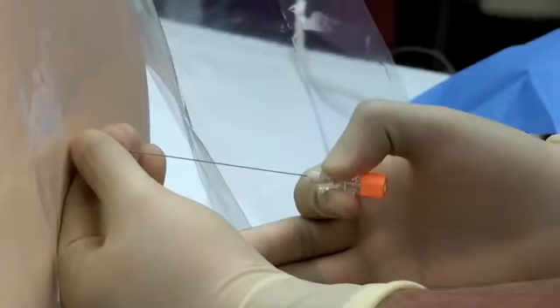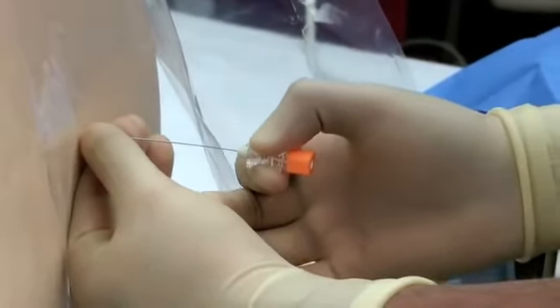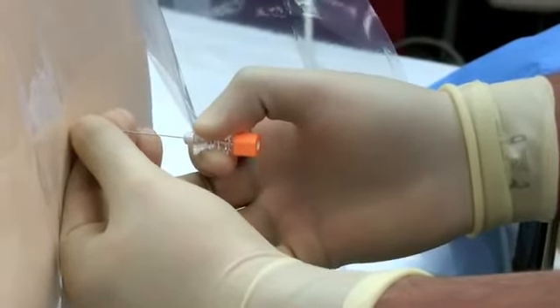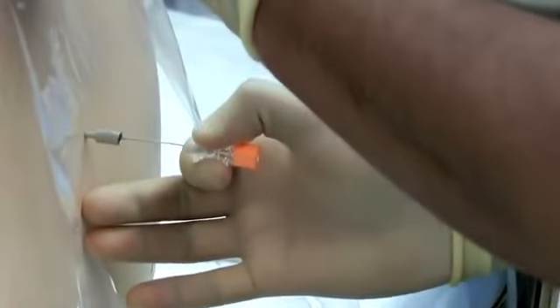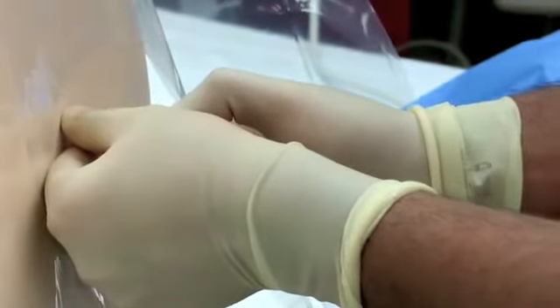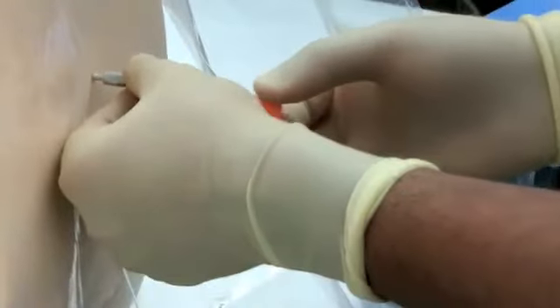I'm going to place my spinal needle through the introducer needle and advance until I feel a popping sensation. We withdraw the stylet each time you feel a pop to assess for CSF flow. Feel a pop.